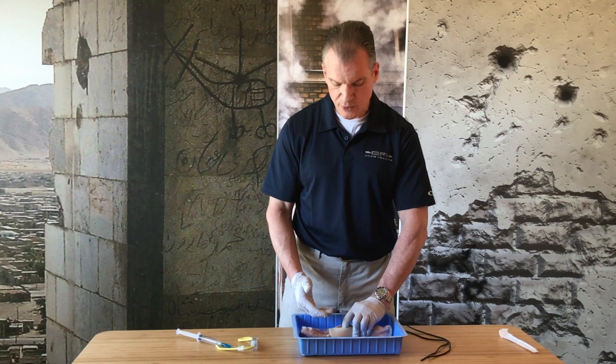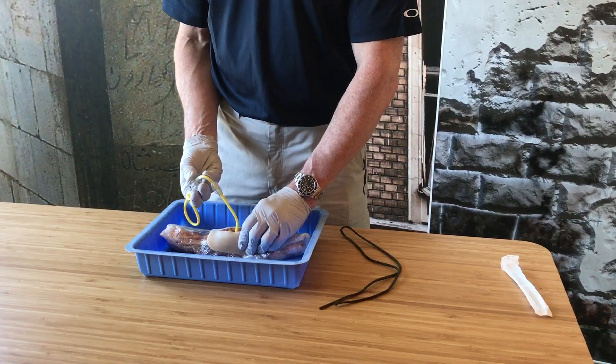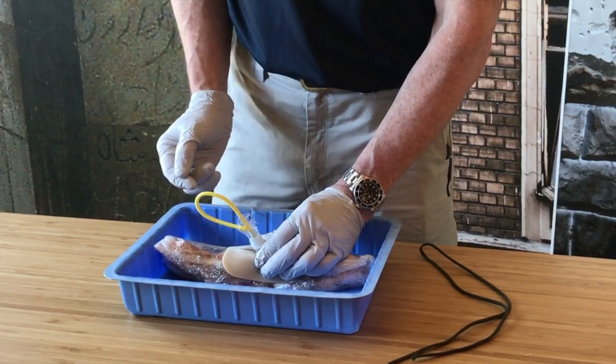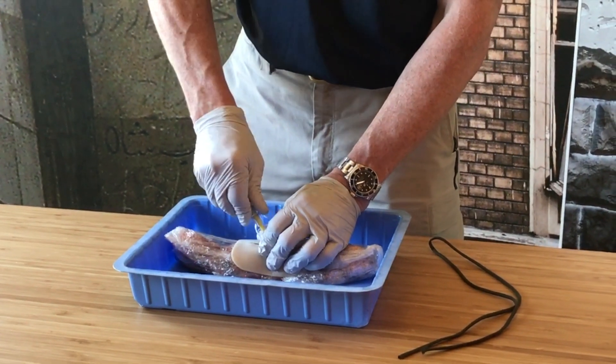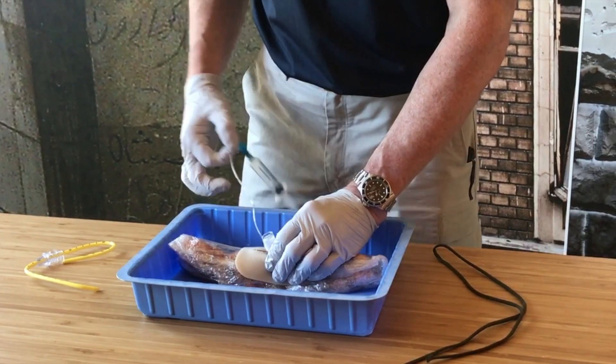If your casualty was breathing, they'd now be breathing in and out through that hole. At that point we can take our airway, stick it in the hole and start feeding it in. Now at this point there's a stopper here so the casualty can't breathe through this. We need to uncork him and pull this whole thing out, and he would now be breathing through that hole.